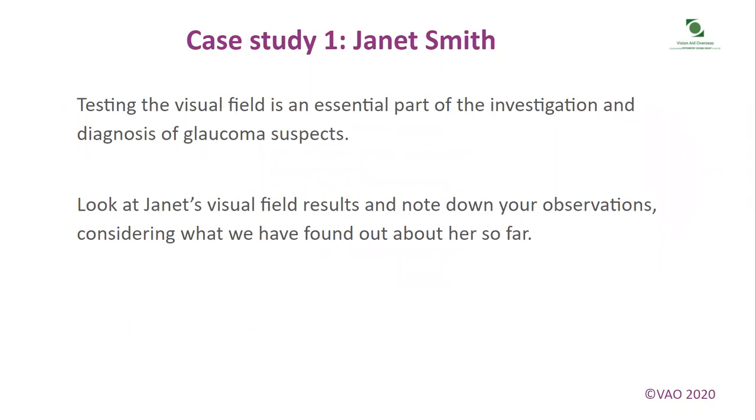So we can look at case study 1 with Janet Smith. Testing the visual field is an essential part of the investigation and diagnosis of glaucoma suspects. Look at Janet's visual field results and note down your observations, considering what we have found out about her so far.